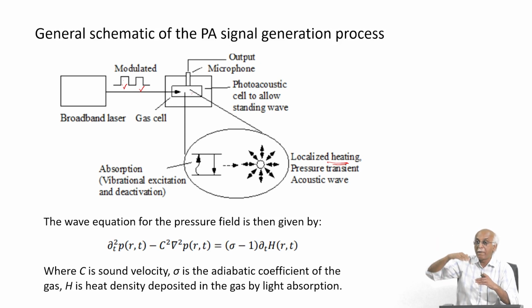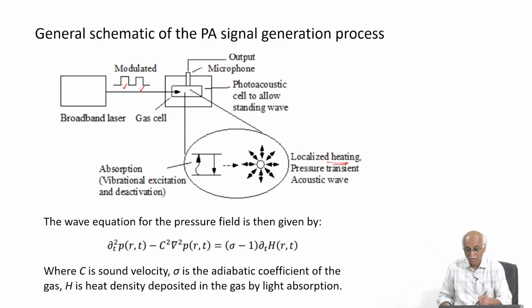Some of them may come back to the ground level with similar optical radiation, which we are not considering, but there will be some molecules which come back through various other transitions to the ground level, and those transitions will generate a lot of heat. So, that heating comes into picture.